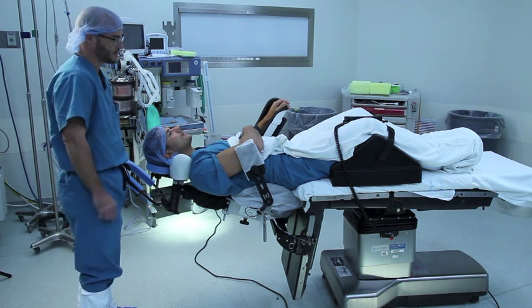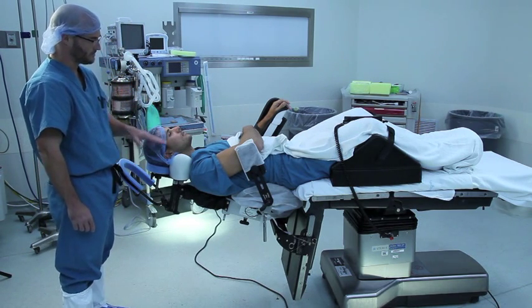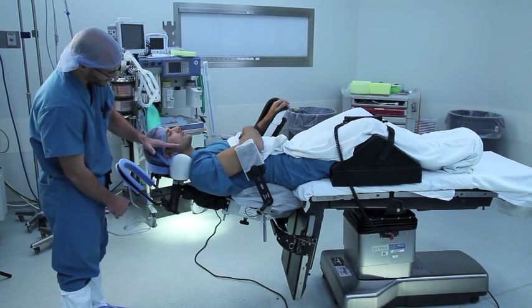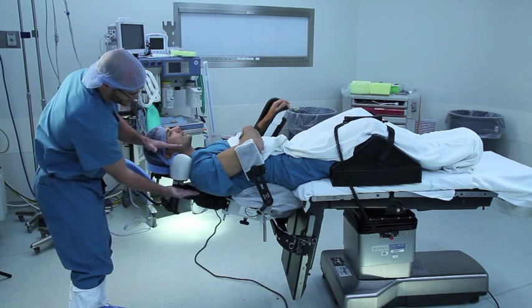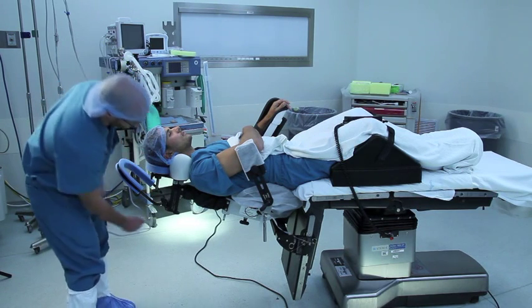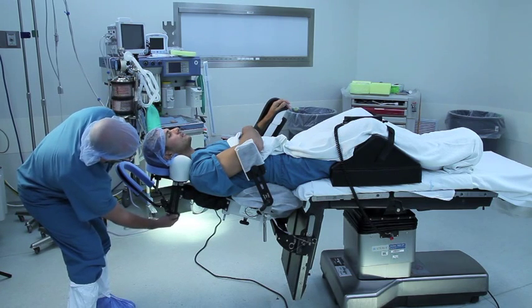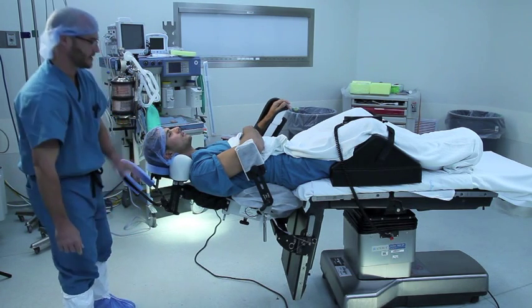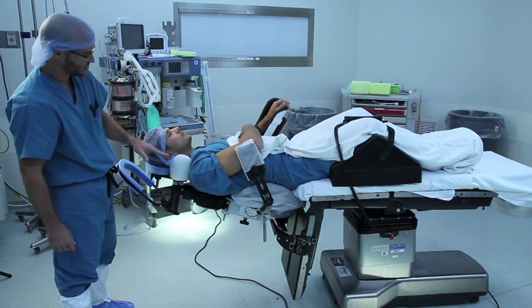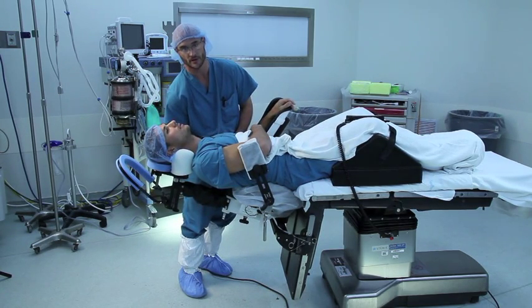During intubation, the patient's arms are controlled by the lateral pads. The anesthesia doctor will want the patient in the so-called sniffing position, such that their head and neck are displaced anterior to the thorax. This can be achieved in many patients by adjusting the AP adjust either down or up. Once anesthesia learns how to do this, they can acquire the sniffing position in the initial positioning. The thoracic assist may help achieve the appropriate position.